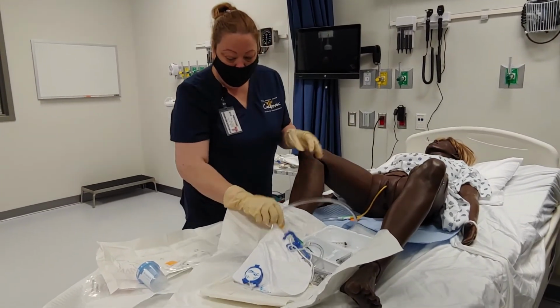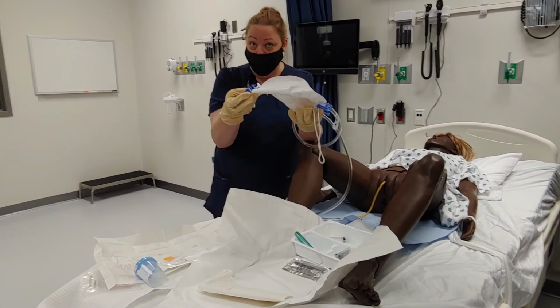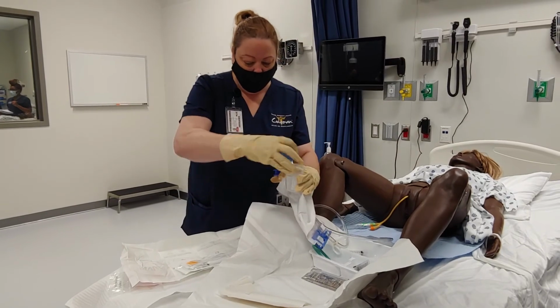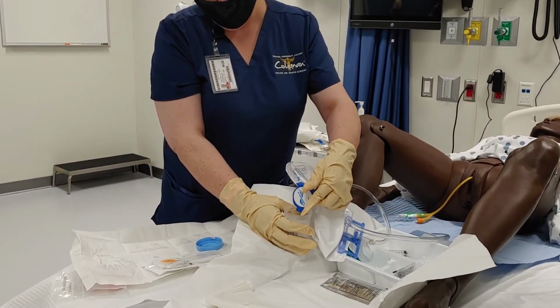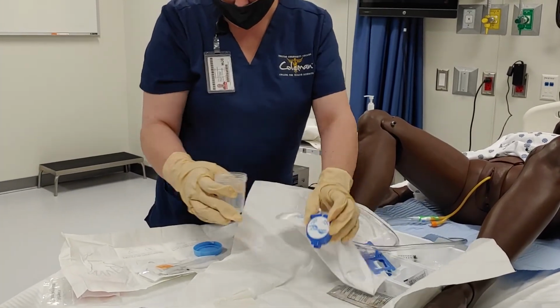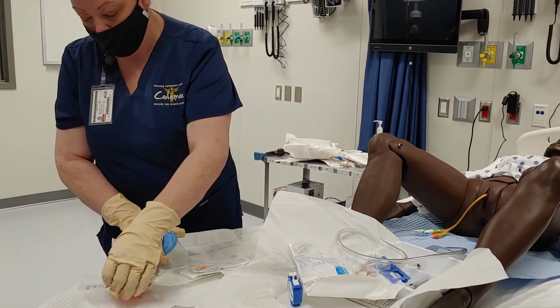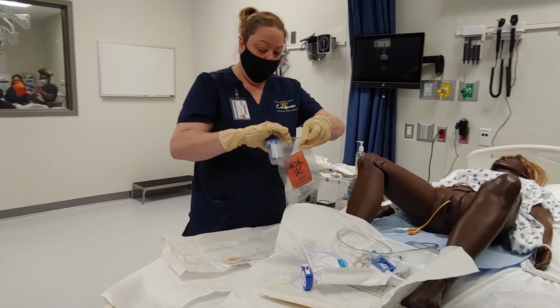Then I can go ahead and take a sample from this, because remember, this is all sterile. So as the urine came out of this, I could go ahead and take the lid off of my cup, open this up, get my sample, go ahead and close it back. And now this is going to be good to go. Then I'm going to go ahead, like I said, finish cleaning them up.